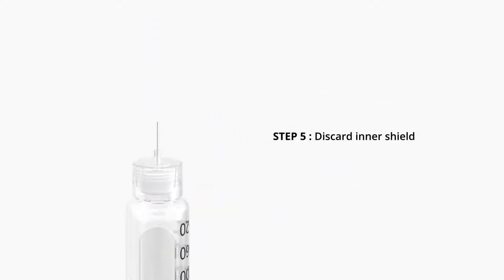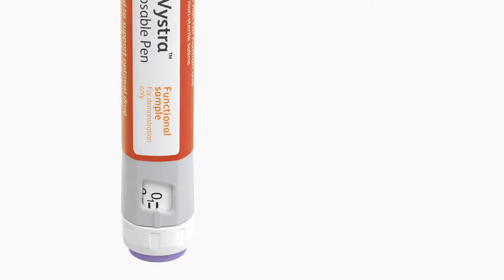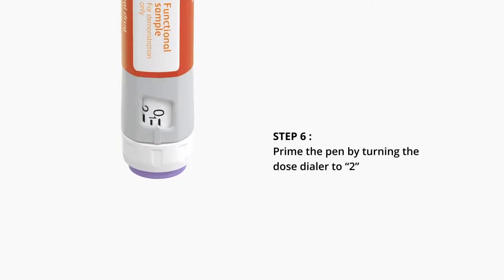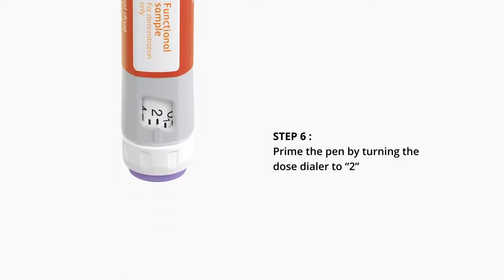Step 5. Discard inner shield. Step 6. Prime the pen by turning the dose dialer to 2.